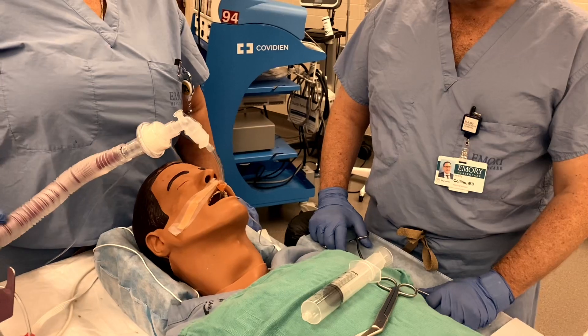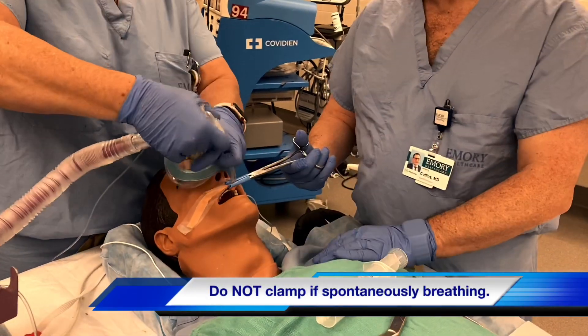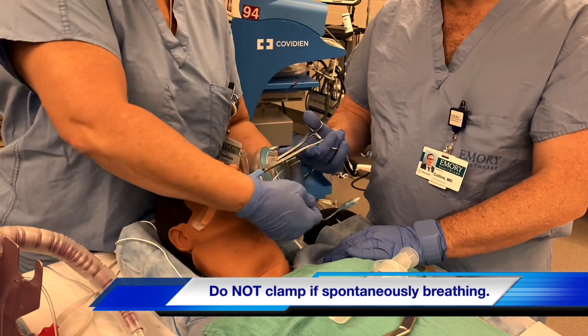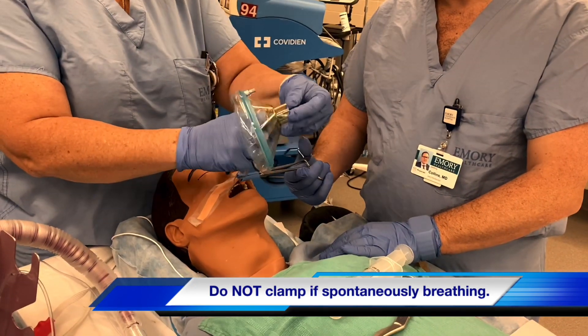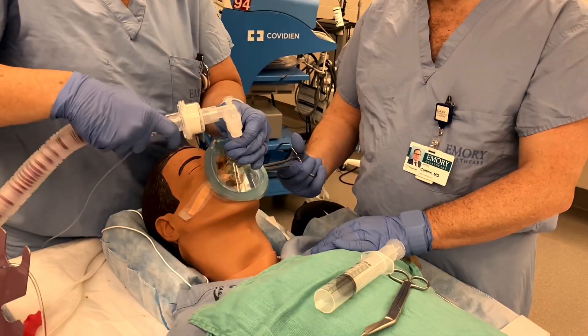You'll pause the vent, let the patient completely exhale, clamp the tube. Take off the connector, get the pilot cuff through, reconnect, unclamp.